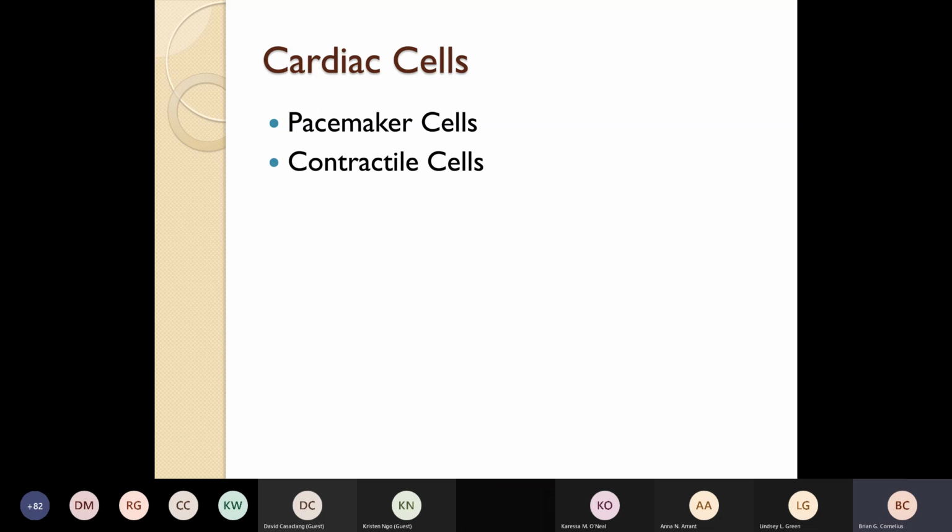The rate, and how things process through there, is also another key thing for you to remember. You're going to see a couple of slides where I keep reiterating that heart rate, because as you start doing EKG interpretation, that's a good guide for you. Not only the morphology of the complex, but looking at the heart rate. That's also a good reference point for you to try and figure out the origin of the rhythm. So it's very important for you to know that.